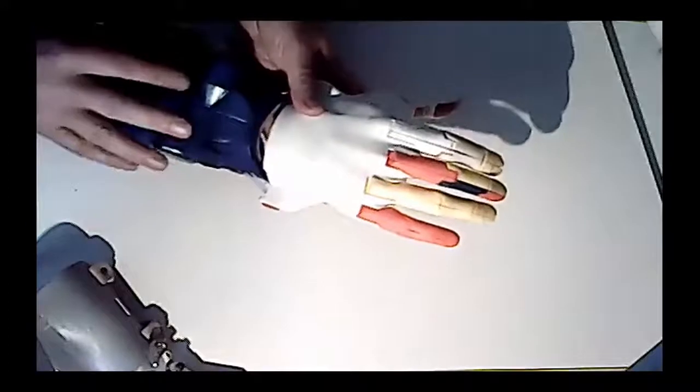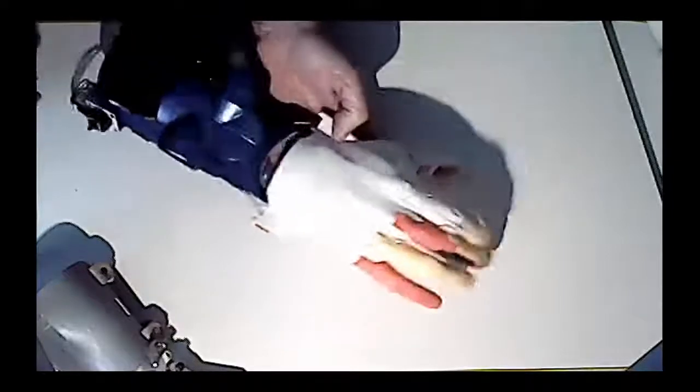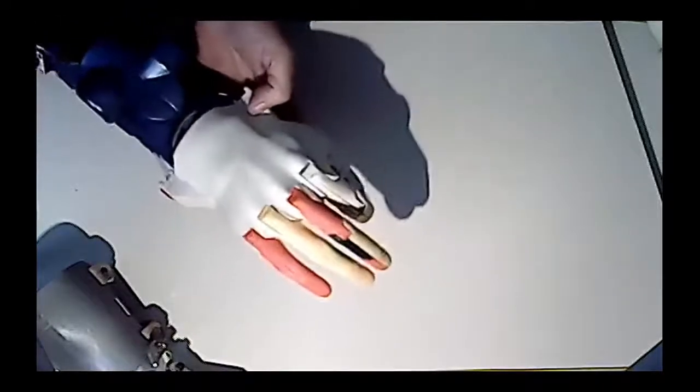So this is the result of a group of students working under Philip's control with our requirements. She benefits from the hand we've done ourselves. And here they adapt some servos and so on to make the hand work. So let me try. Normally a demo is not working. Okay, so don't smile. Very nice. It works.